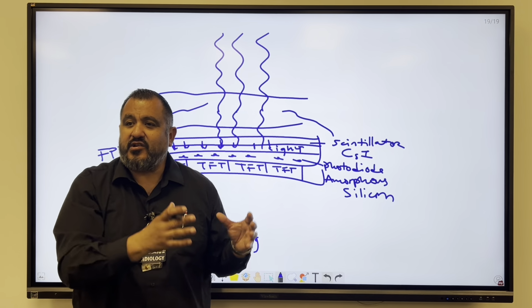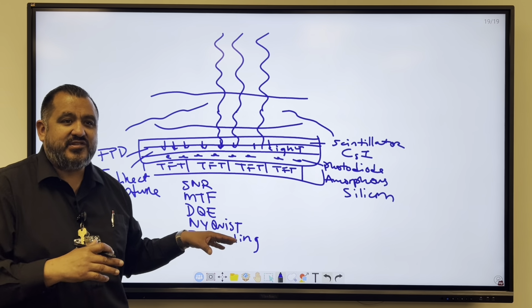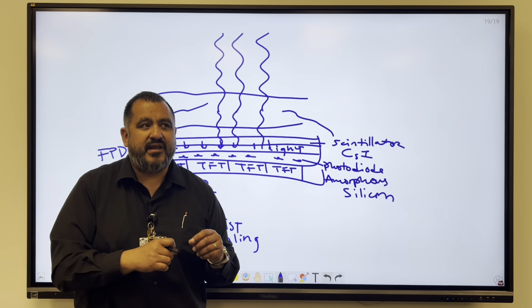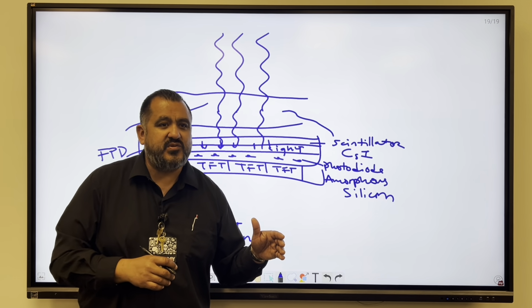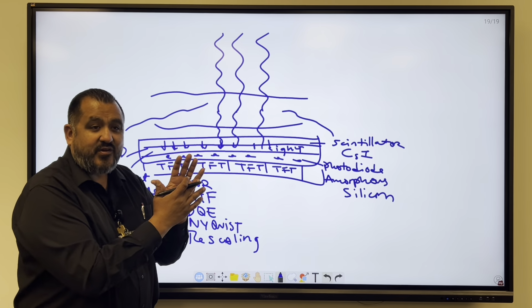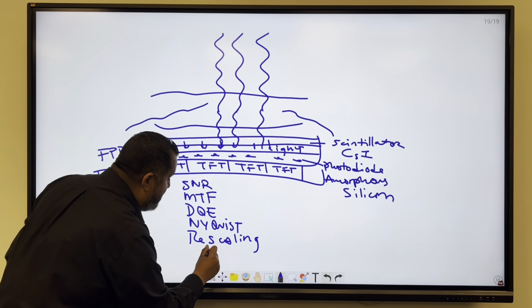If you're off in technical factors, guess what? The system says, don't worry, I got you. The automatic rescaling, the histogram modification is going to adjust it for you. It's going to default to that preset scale of contrast that the histogram was telling you this is what you should have. So you're going to have Nyquist theorem, automatic rescaling. You're also going to have a histogram analysis occur.